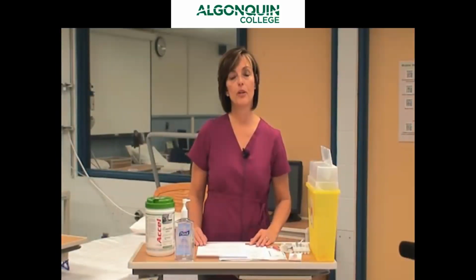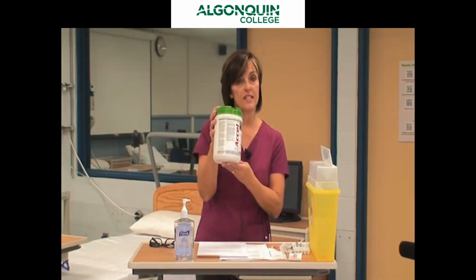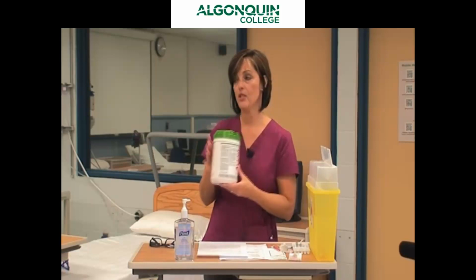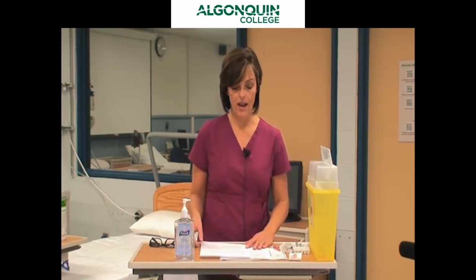Okay, so today we're going to talk about mixing and administering IM medications. Before I get my supplies, I would have cleaned my table with disinfecting wipes. That was already done, and there is another video that demonstrates how to do that. So the next thing we're going to do is talk about intramuscular injections, or IM injections.